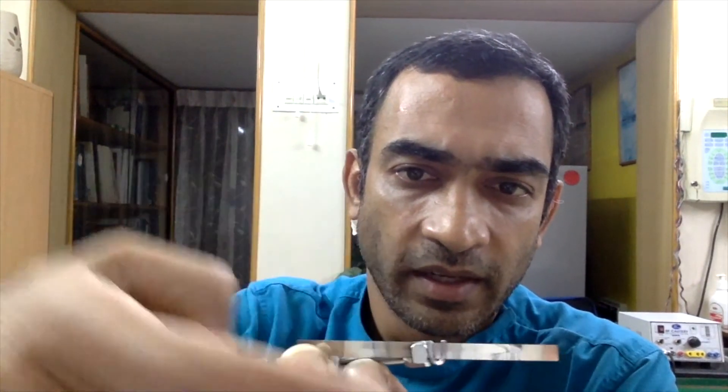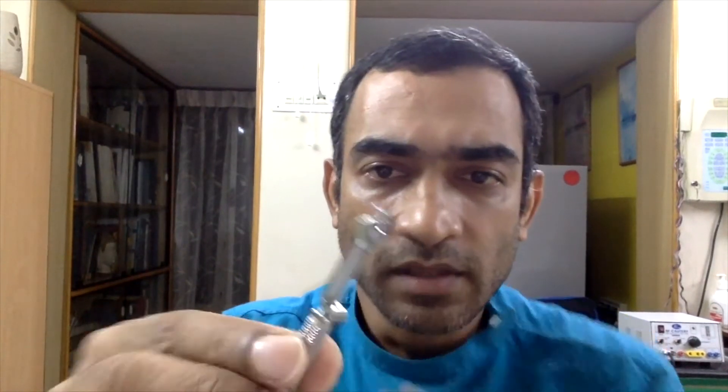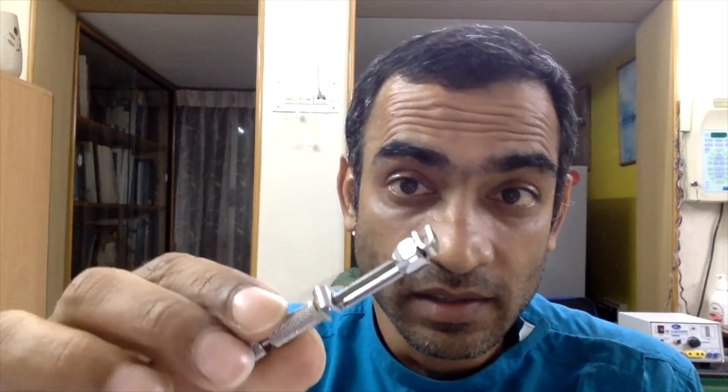Then unscrew the small nut and try again. Now the band is seated all the way down, which means you have unscrewed enough. This is the basic position of the Tofflemire retainer before you start.